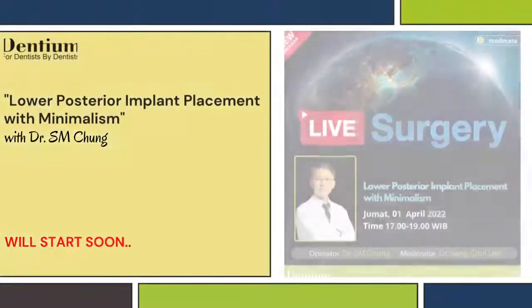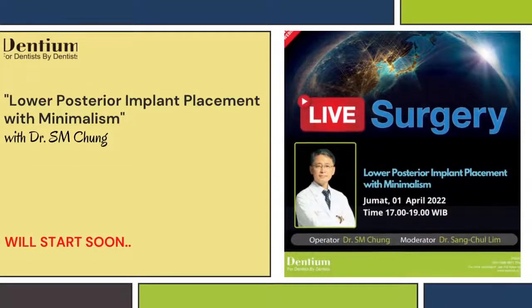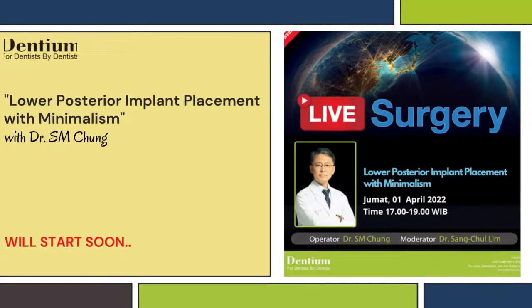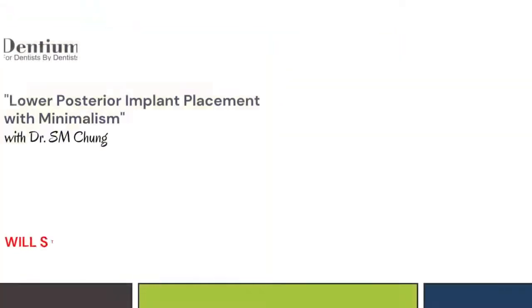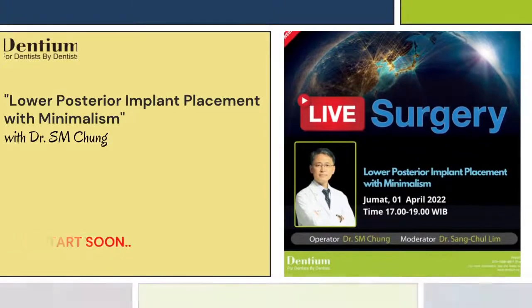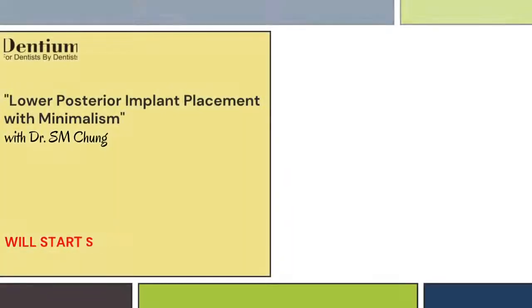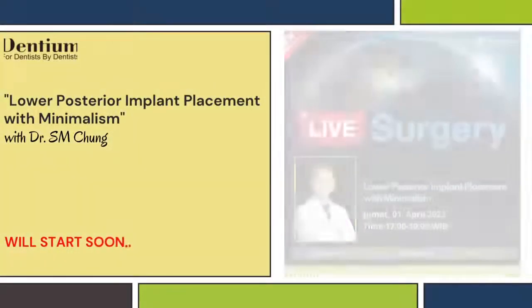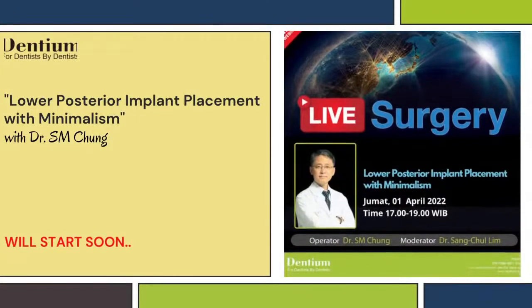So this one is the intraoral view. As you can see, I already mentioned the number 44 area buccal depression here, and a little bit of gingival inflammation. Also, this patient wore a removable partial denture for a long time. So the posterior mandible has a reduced ridge.